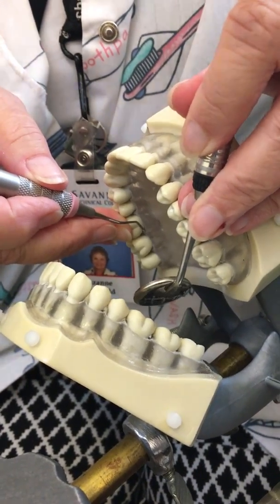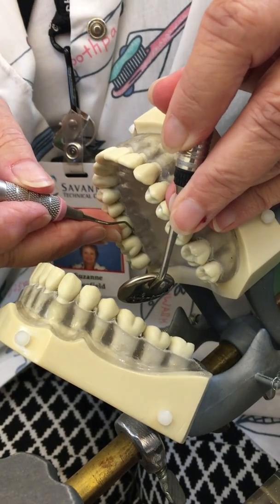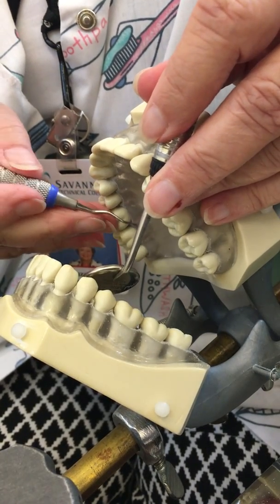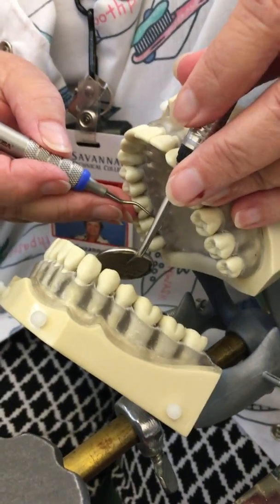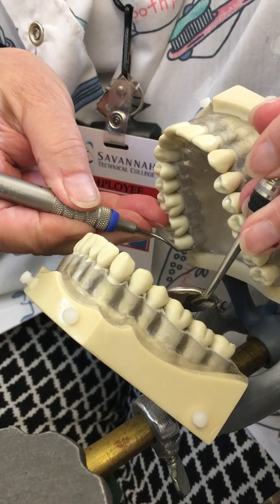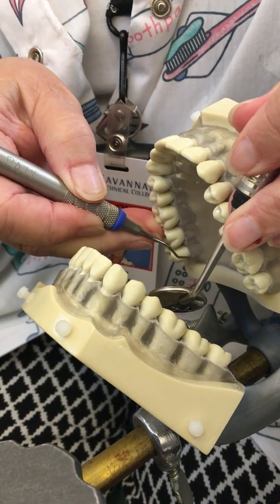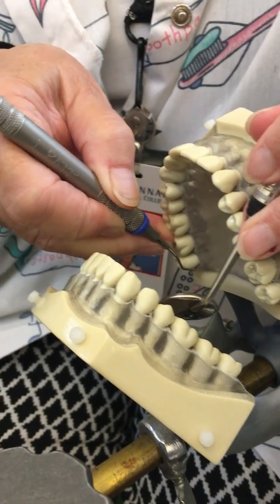You can look in the mirror and see it the way I'm seeing it, because I'm going to be using complete indirect vision. I'll place my fulcrum on tooth number three with a modified pen grasp, extend my instrument slightly, roll over my fulcrum, extend my toe apical, and place it at the distal line angle — pulling closed and then open. Your shank should be on the same side you're working on, and your handle should be as close to being parallel as possible.